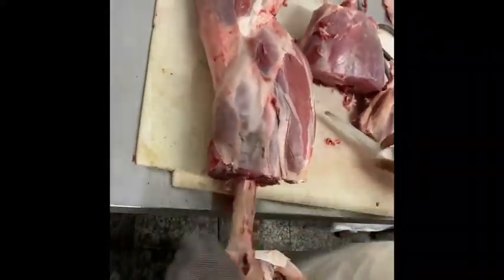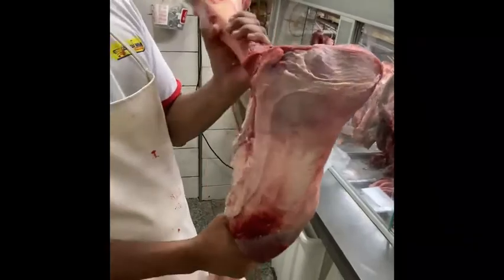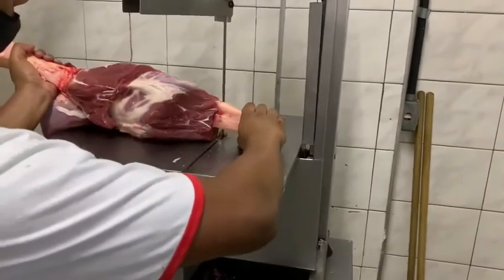We then observed knee flexion, still with the femur and tibia intact. We then performed a transverse osteotomy of the tibia and femur at the same location where the soft tissues were resected.